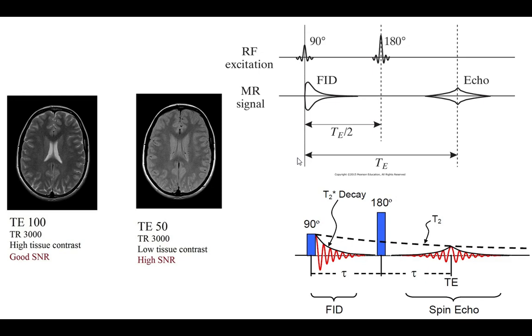We might have to do some of this next time, because there's a bunch of ones here, but I think this is a good discussion. So here's another one. This is just dealing with the echo time. If I cut the echo time, I'm keeping my recovery time the same just for comparison.